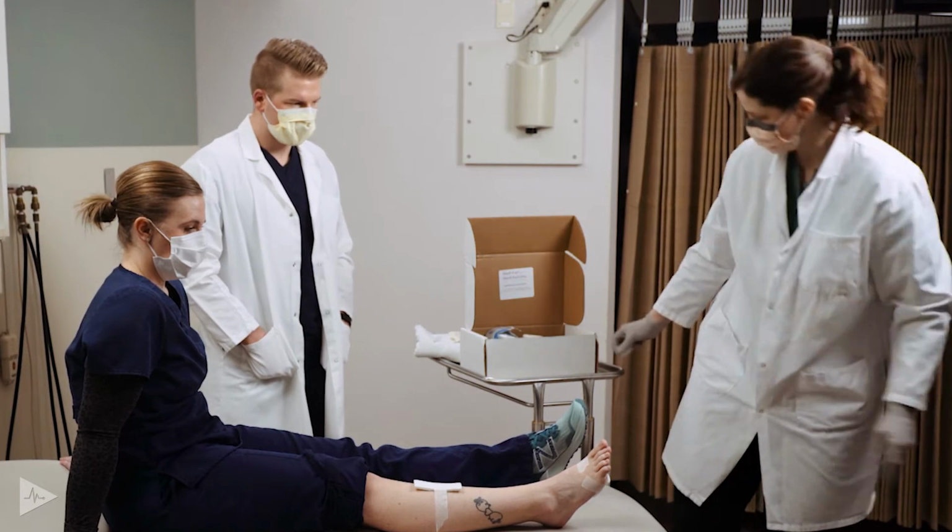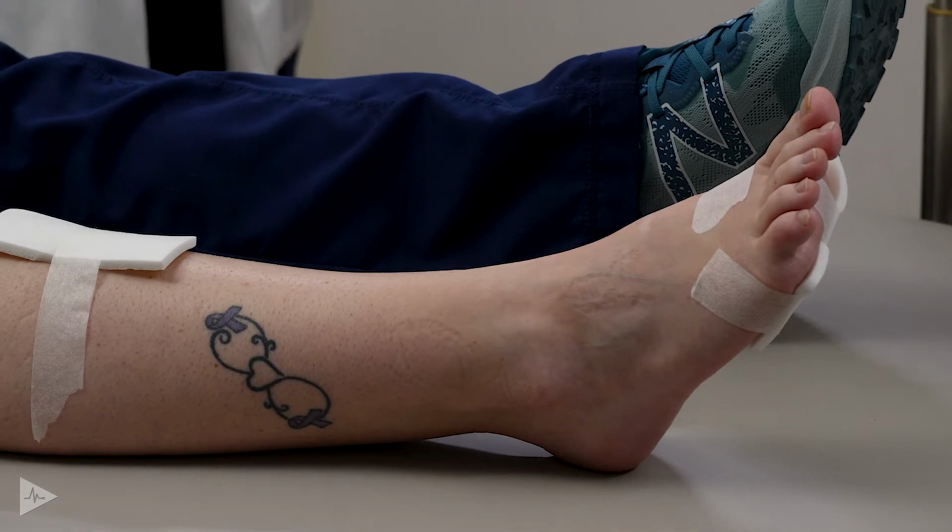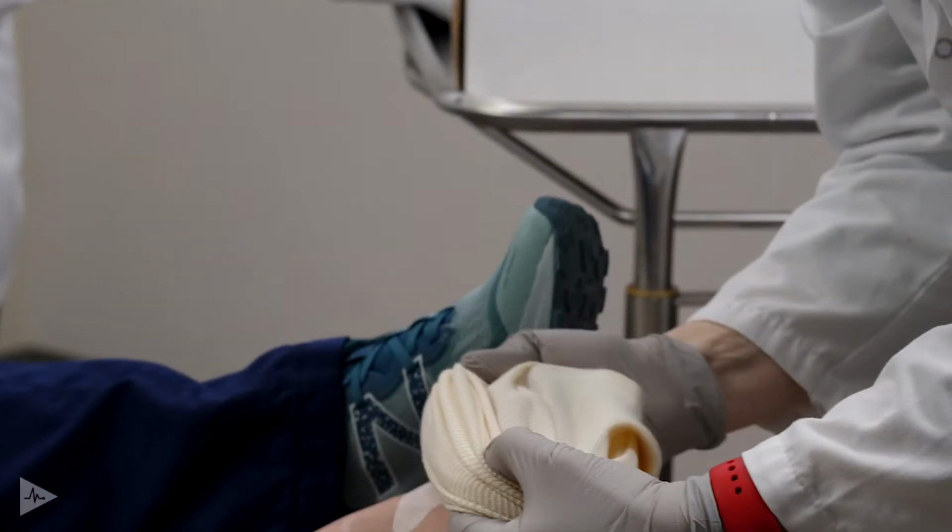Now that we have the dressing in place, we will apply the first protective stocking. You want to leave a little bit at the end for the toes.